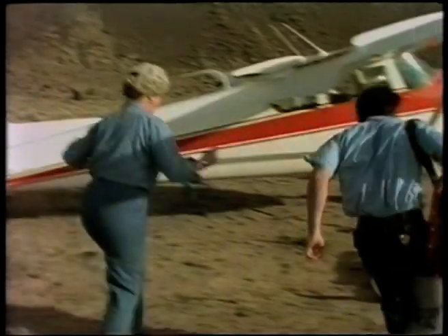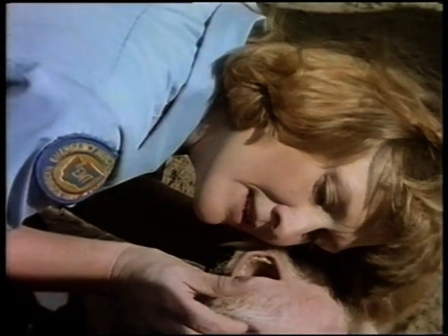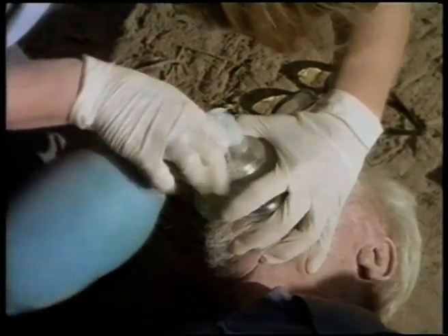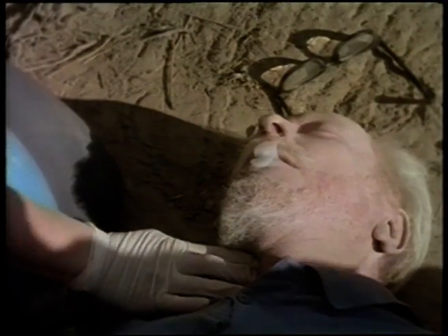When our EMTs arrived on scene, they immediately began basic cardiac life support procedures. They tried to arouse the patient. No response. They checked his breathing. No respirations. After giving 2 breaths, they checked for a pulse by palpating the carotid artery, allowing at least 5 seconds to check for a pulse. If the patient has a pulse, maintain the airway and support respirations as needed. In this case, though, they found no pulse.